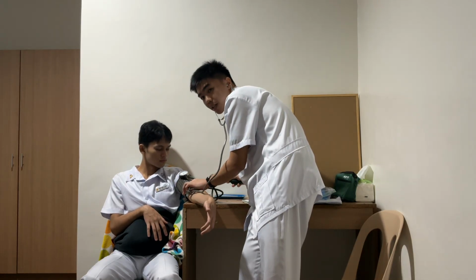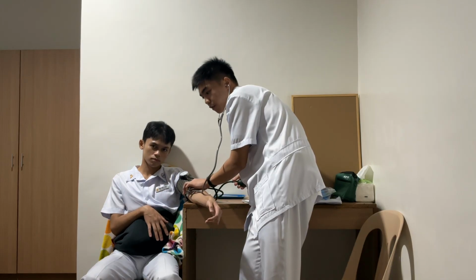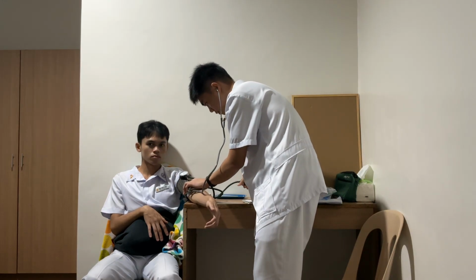So I'm going to raise it, approximately pumping the cuff to 30 millimeters of mercury above the point where the sound disappears. So slowly listen.